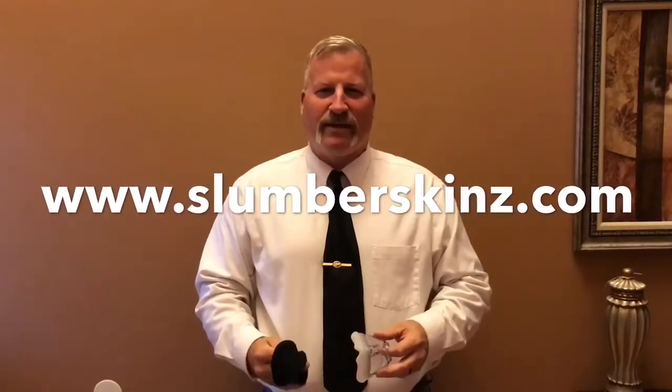Congratulations on the purchase of your SlumberSkins mask liner. I'm doing a quick tutorial to show you how to put your mask and your mask liner together.